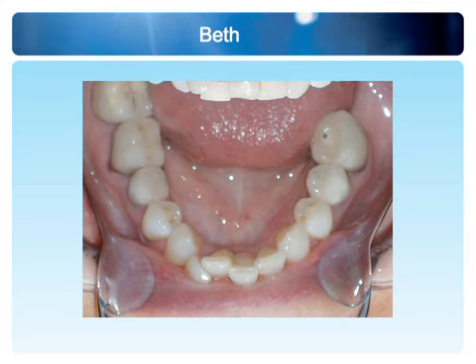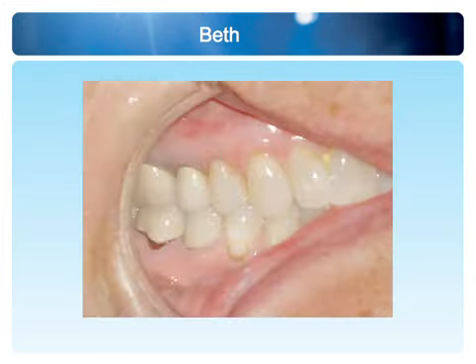And this patient does not have a proper occlusion set up in the posterior when the teeth are leaning that far in. So now we take a look at the full diagnosis, and we know that the upper arch allows us to do some expansion in the posterior. Then we can work on our buccolingual inclination of those lower posteriors, uprighting those teeth, which should open up some room to get these lower anteriors in place. So let's take a look at her right side.